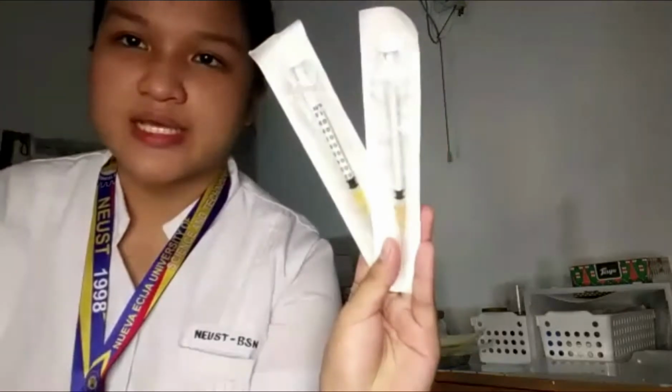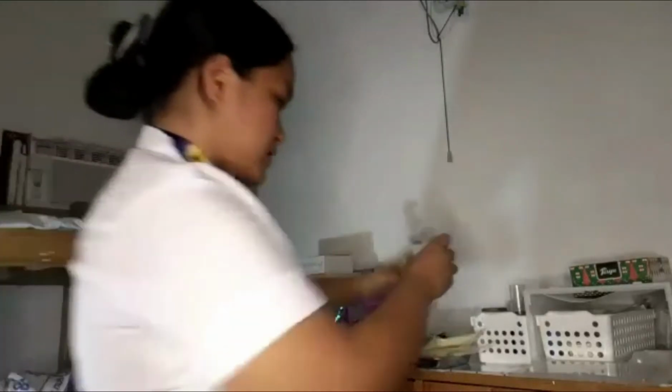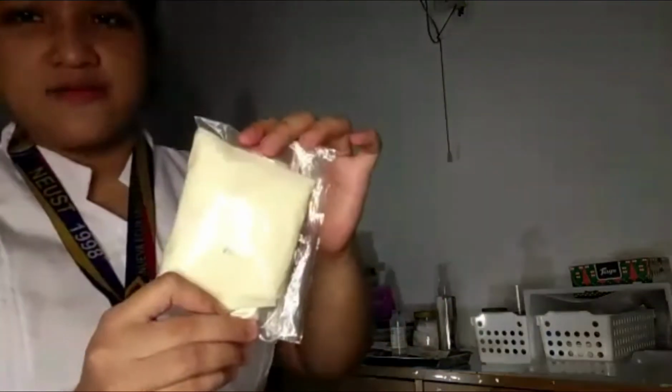So here is our equipment. First is the client medical record. A sterile medication, a syringe and needle of a size appropriate for the amount and type of solution to be given. Here are the usual needle sizes or syringe sizes used in intramuscular medication. The antiseptic swabs and the clean gloves.